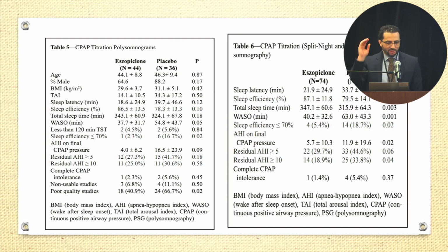We have to be careful with that, because if you look at the patient characteristics, these are mostly relatively younger patients, with an age of about 44 to 45 plus or minus 10 years. They ruled out patients with congestive heart failure, with significant comorbidities, and patients who are on narcotics and pain medications. So we have to be careful in using those medications when we set up.